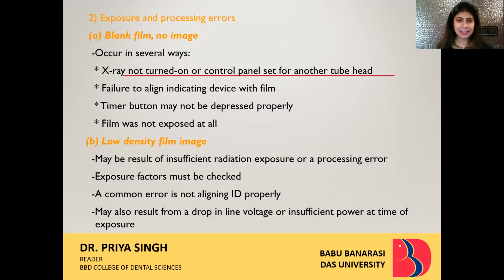Failure to align indicating device with film. As I've just told you, X-ray will not cast on the film itself. So the film will be completely blank or white. Timer button may not be depressed properly, so the exposure will not take place. Film was not exposed at all. So all these will lead to a blank image or completely no image being formed.